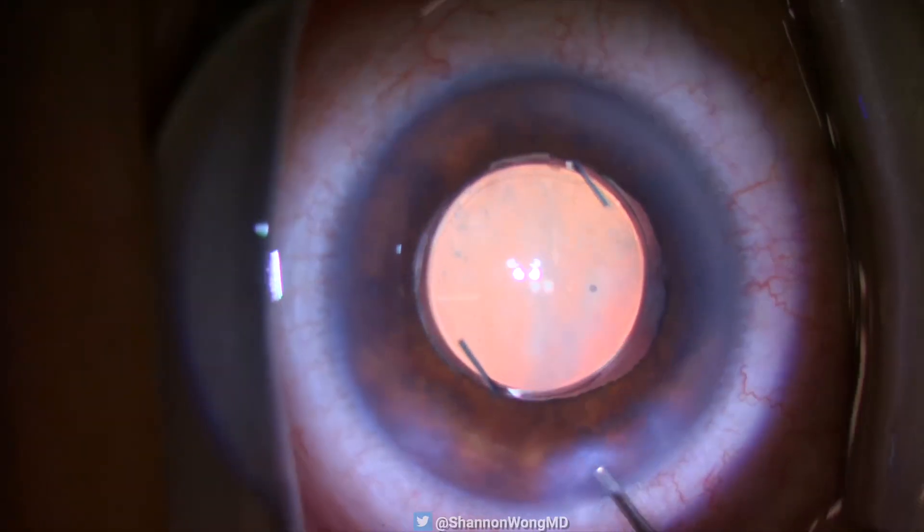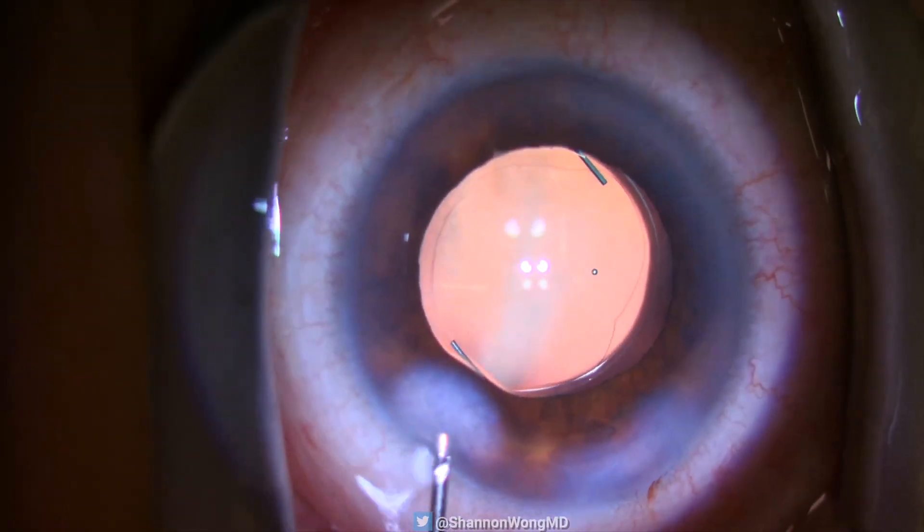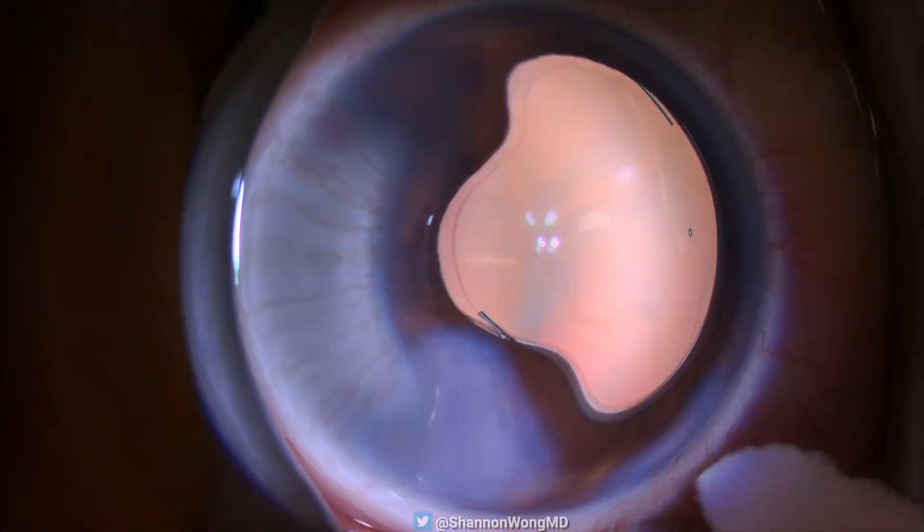I hope this video helps give you a solution if you encounter this situation during cataract surgery. Have a wonderful day. Bye-bye.